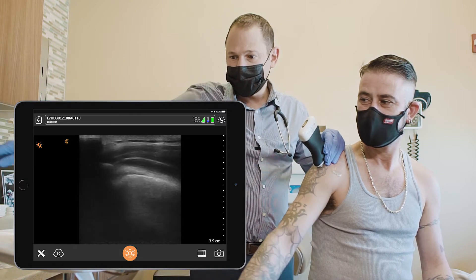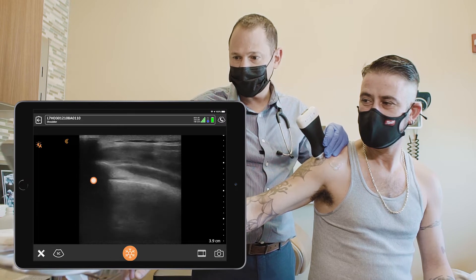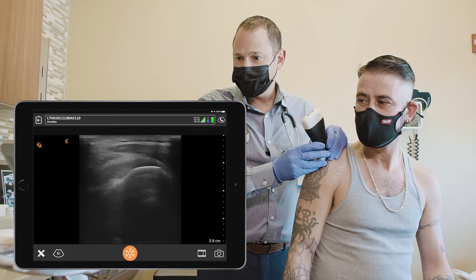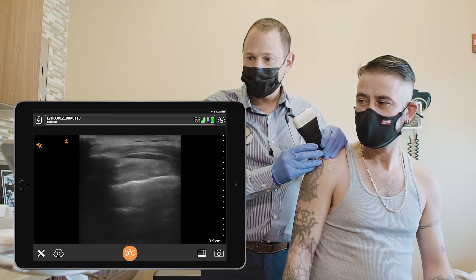If you extend your arm to the side, you can see the tendon disappear underneath the acromion. You can put your arm down and access the subacromial space through this view as well, by going between the tendon and the acromion.